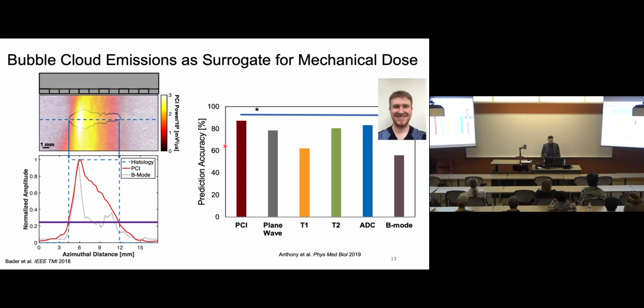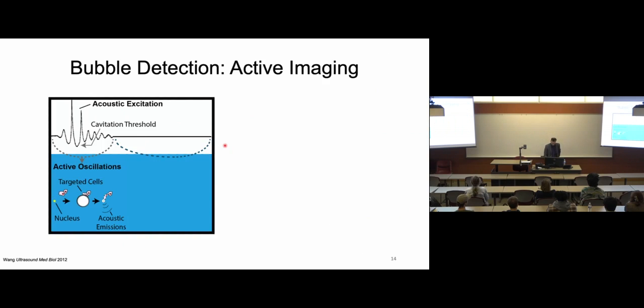Moving forward, we're hoping to develop these imaging techniques as a means to provide some sort of mechanical equivalent of a thermal dose. Thermal dose is a very well-defined relationship between heating cells and the degree of cell death. So we're hoping to move acoustic emissions toward being a mechanical equivalent of that.